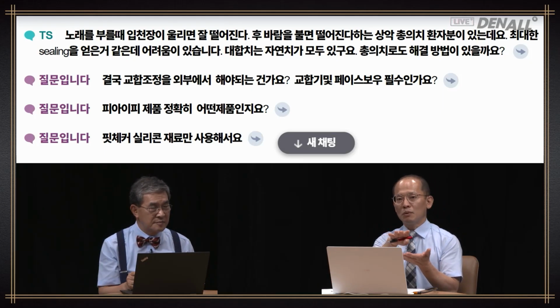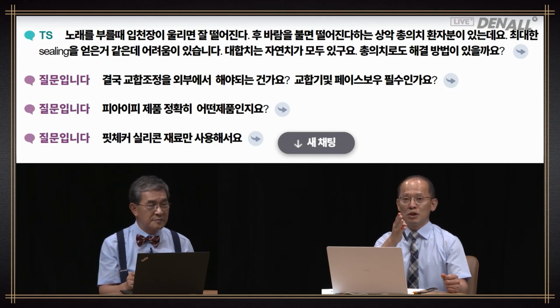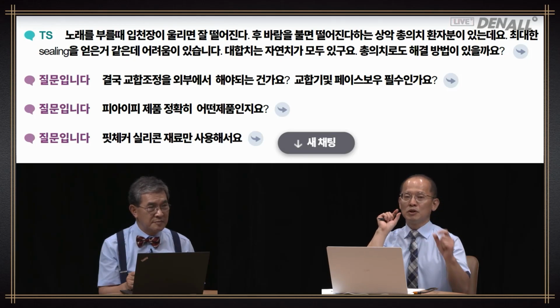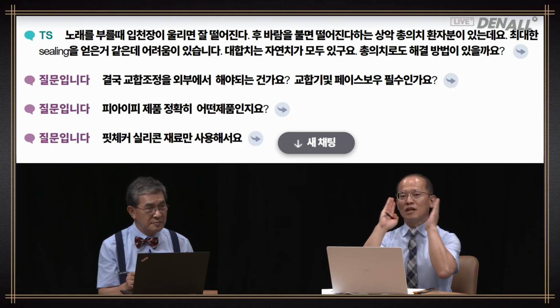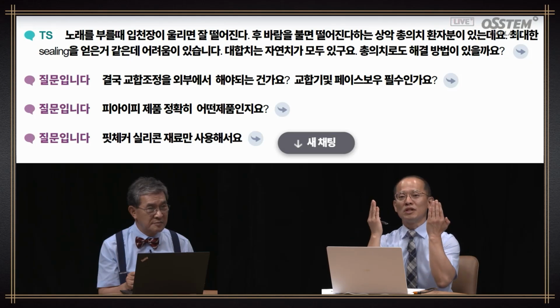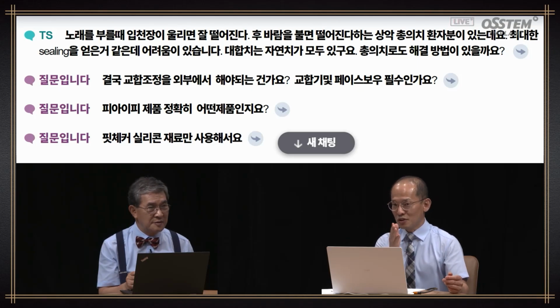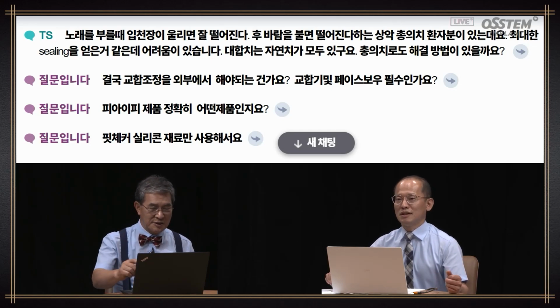That's the final result. So the occlusal plane is adjusted because of the opposing natural teeth, and it becomes off on the vibration line. I think that's that area. In the hamular notch, on both sides, you have the PPS and the hamular notch. The hamular notch is distally a rotating area, and sometimes people have a big space. So if the edge thickness there is thin, then that might be resolved. So please check the thickness.